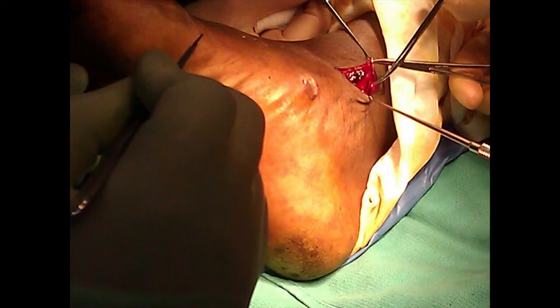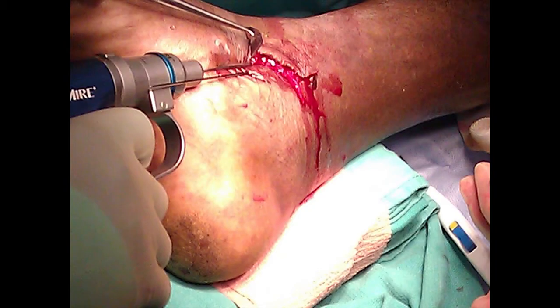You're going to make your skin incision 1.5 centimeters. This is the medial mal incision, by the way. This isn't for that purpose, but we did do two-screw fixation on the medial mal, open that up and percutaneously fix that. Now on the lateral side, you're going to make a 1.5 centimeter incision.